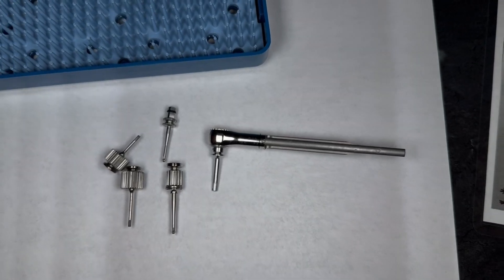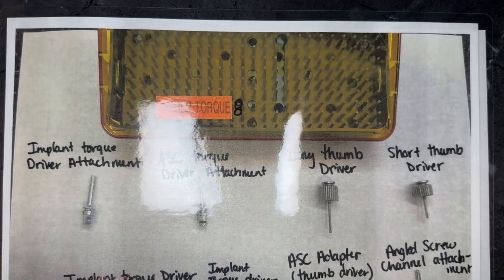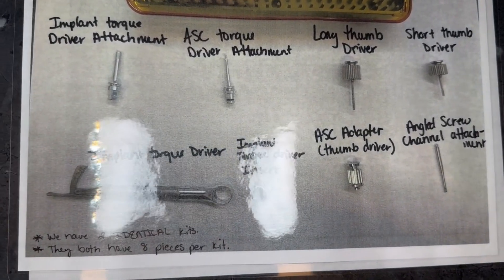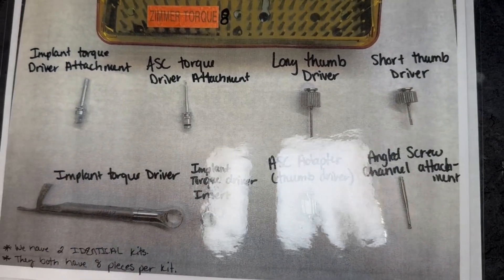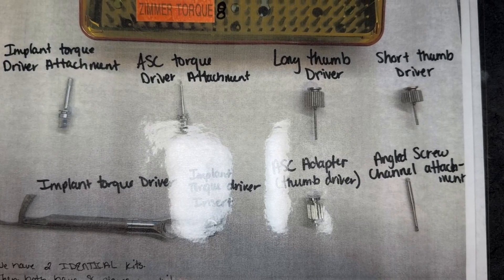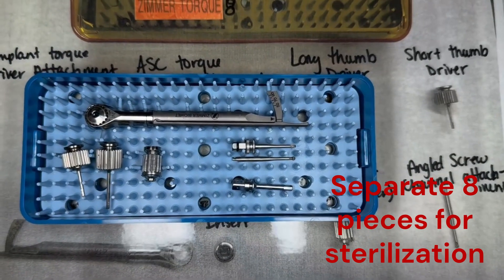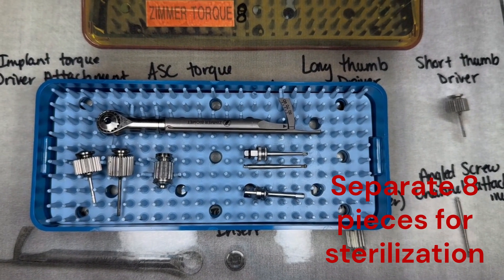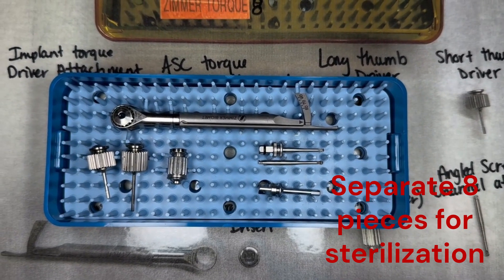We do have a reference sheet that shows all eight pieces that go into this kit — sorry for the glare. This sheet stays inside the cabinet with the kit. Last thing: when we sterilize this, we want to make sure everything is separated into all eight individual pieces so that nothing is jammed inside something else and fails to get sterilized properly.